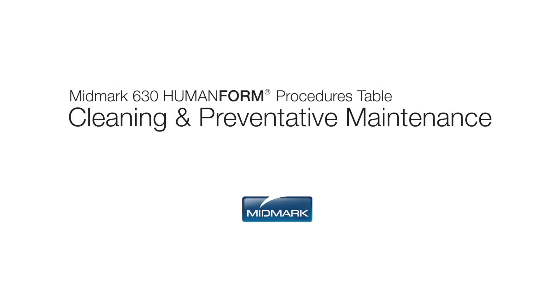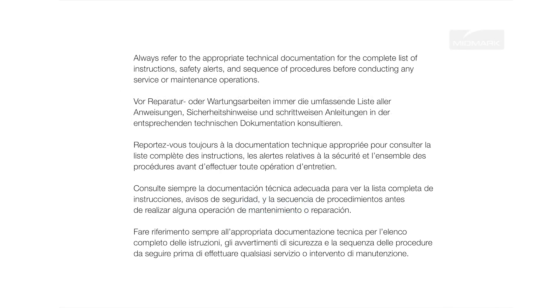This video is an overview of the operation and care of your MIDMARK 630 Human Form Procedures Table. Always refer to the appropriate technical documentation for the complete list of instructions, safety alerts, and sequence of procedures before conducting any service or maintenance operations.